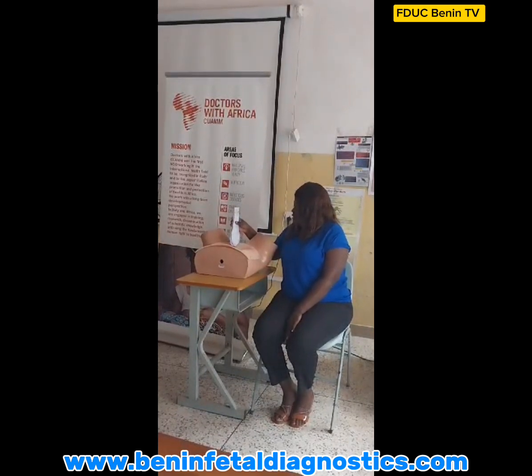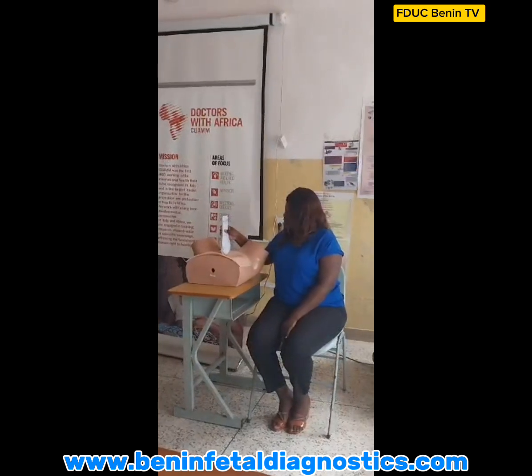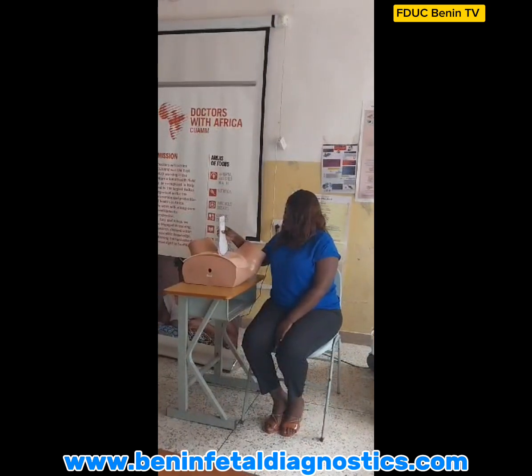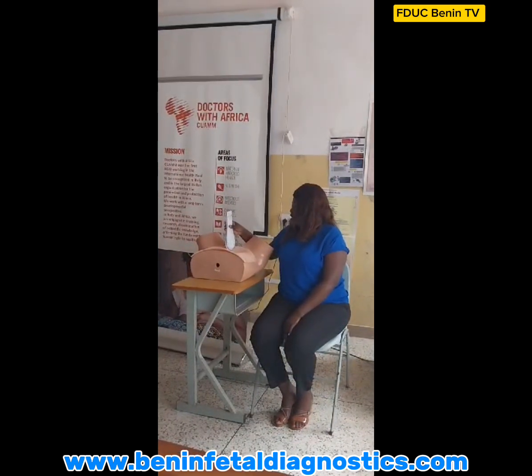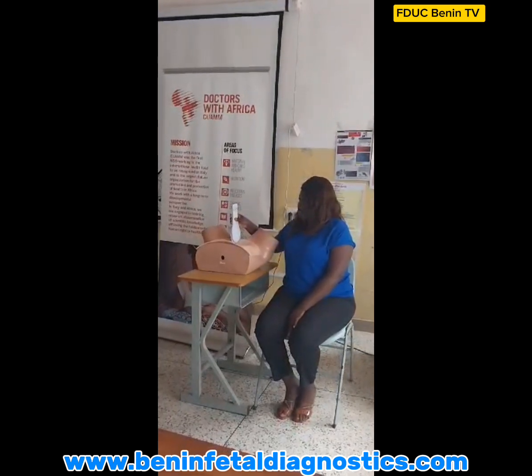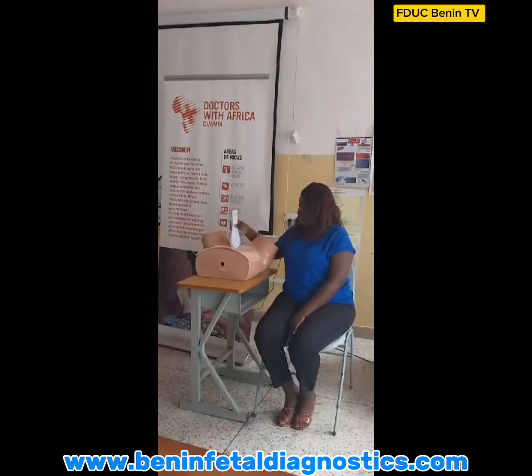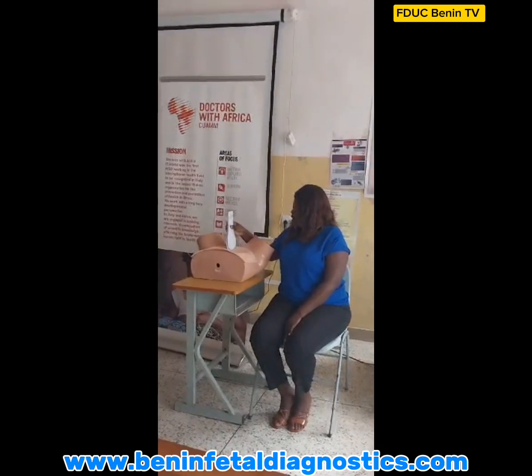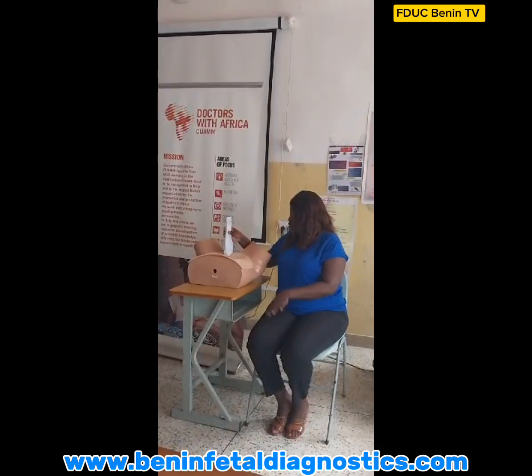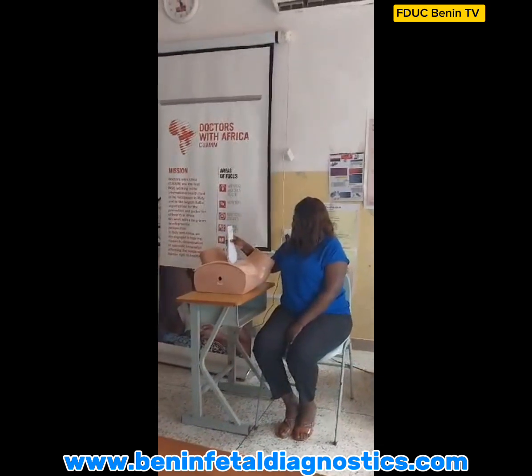On putting the probe above the pubic symphysis, I should be able to identify structures like the maternal bladder, which should be on the right of the screen, and it should also be anechoic. Also, I should be able to identify the anterior uterine wall as well as the posterior uterine wall. I should also be able to identify both the anterior and posterior walls of the cervix as well as the cervical canal. So after identifying these structures, I should also be able to identify whether it's an intrauterine pregnancy, and then also the presentation. Then I'll start sliding.